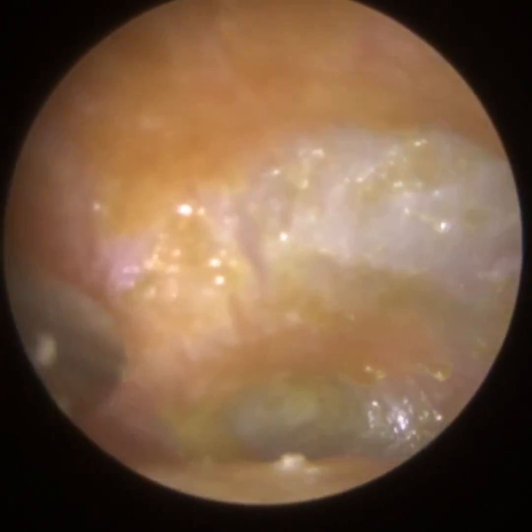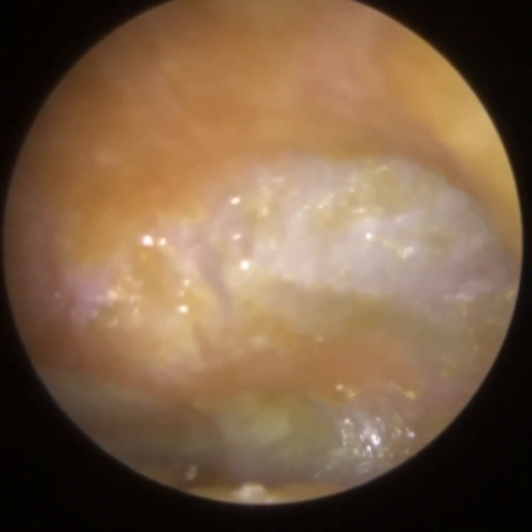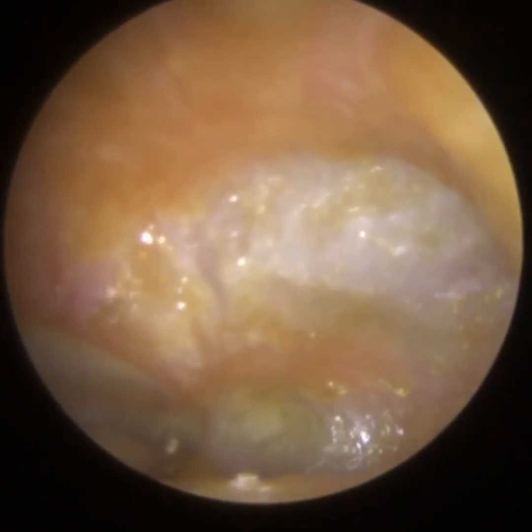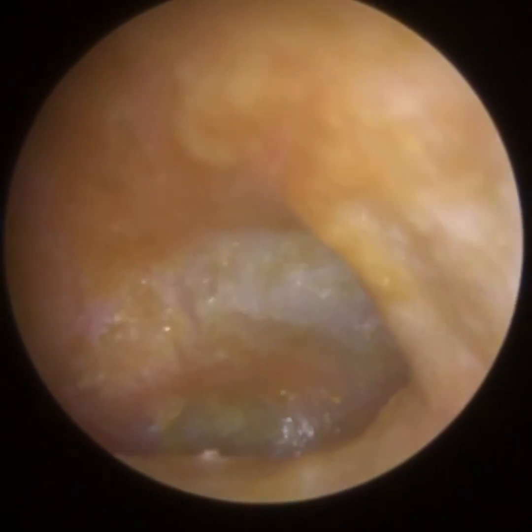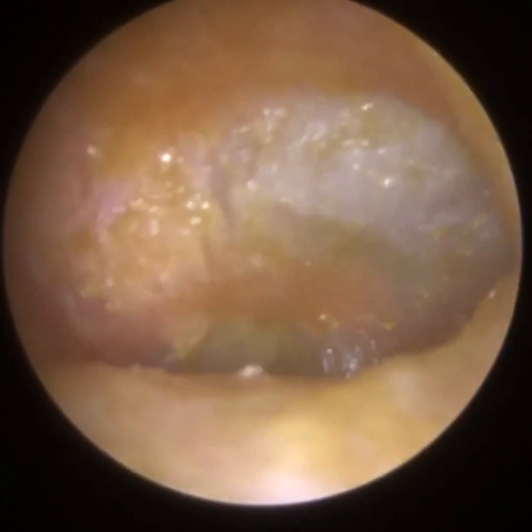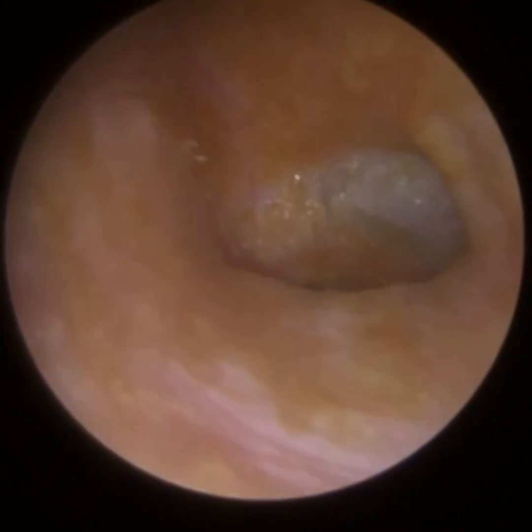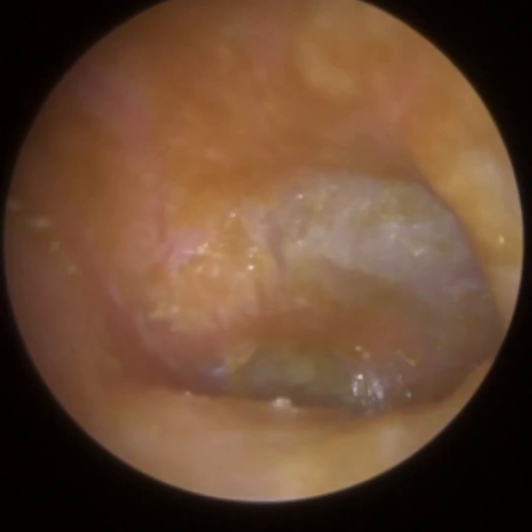But the more I'm doing these procedures, when the patient, maybe it's placebo, I'm not sure, but I don't think it is. I think patients really do have it may only be short-term benefit because, as I said, this otitis externa is still present. So until they get this condition treated, it could be in a few months, they present again with the same condition. The ear canal's all got discharged dead skin coating the ear canal wall and the eardrum.